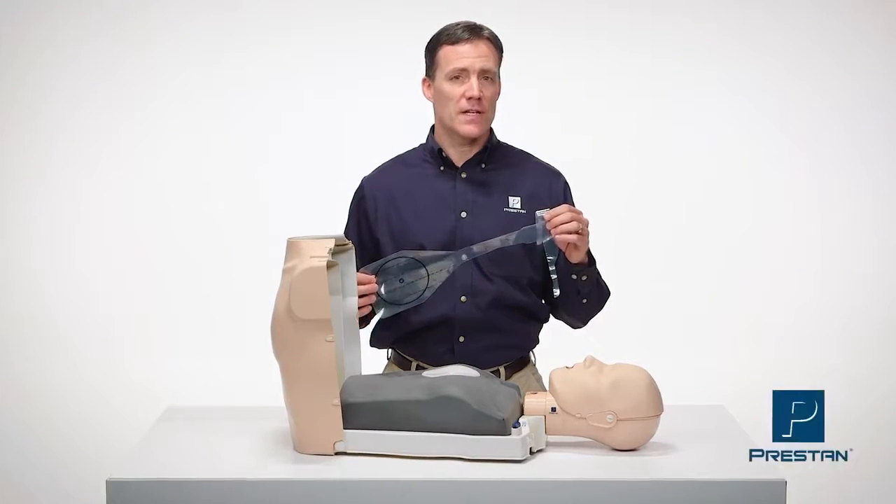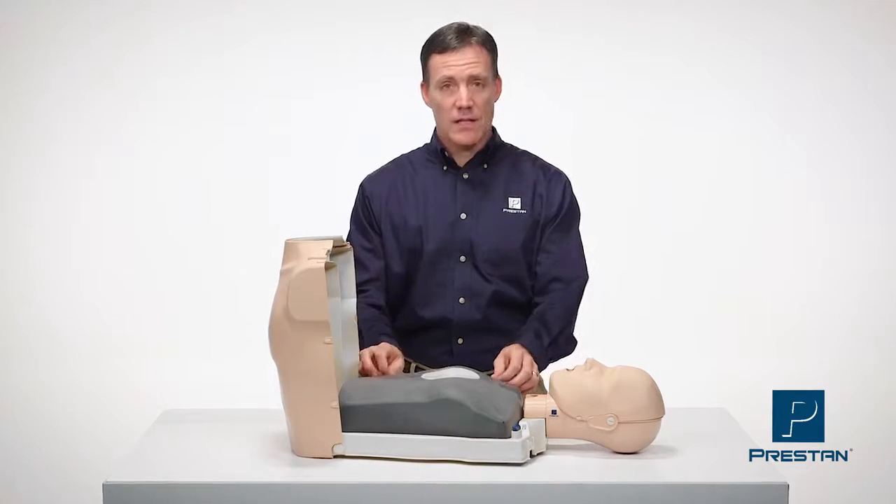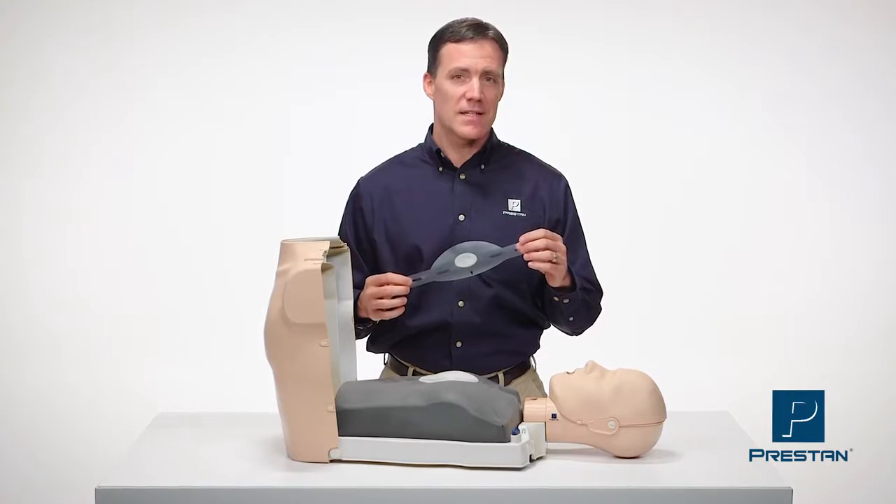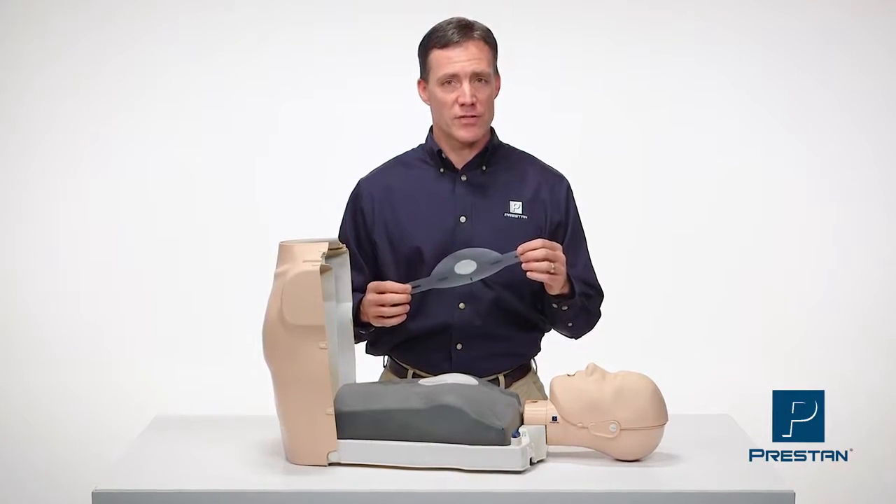The process of installing face shield lung bags and individual face shields is the same for all Preston mannequins. Today we will demonstrate with a professional adult.